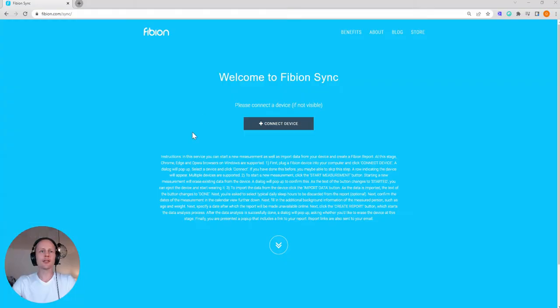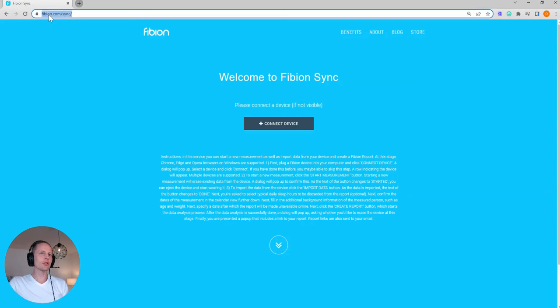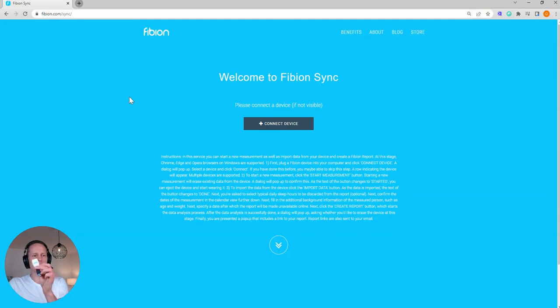In this video I wanted to show how to start a Fibion device measurement with the Chrome extension sync tool. I will show my screen. I'm now at fibion.com/sync and I have connected the device with the USB cable.